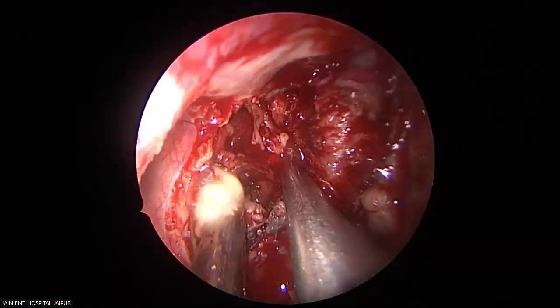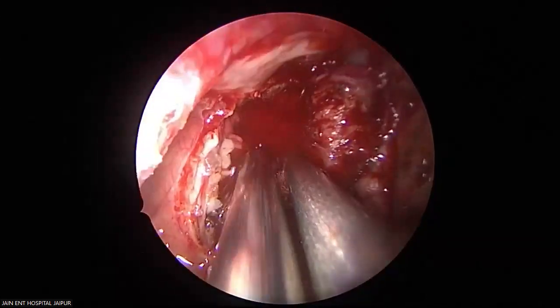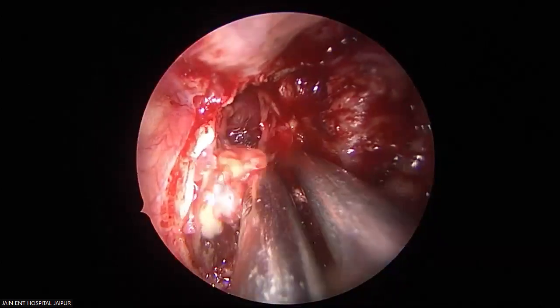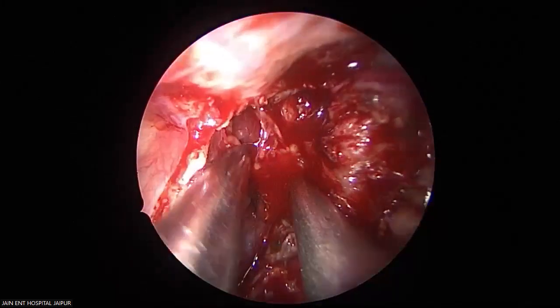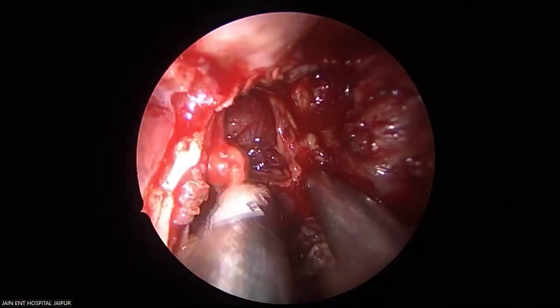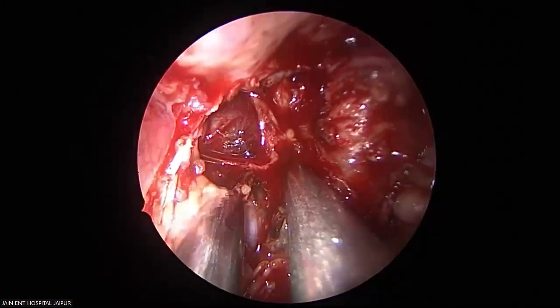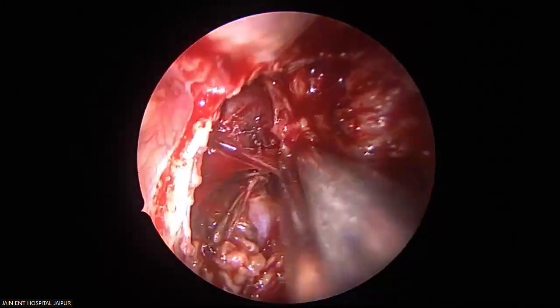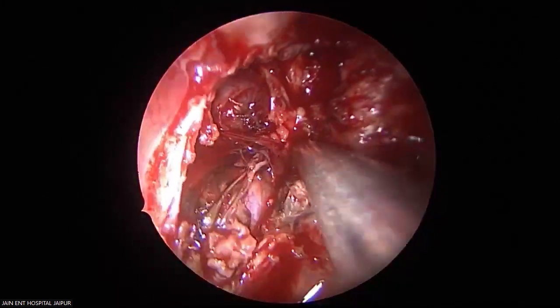See, the more infratemporal fossa fat you remove, the bigger part of the tumor surface you get. See, such a nice window you have.